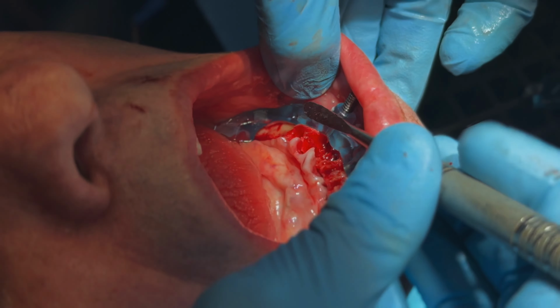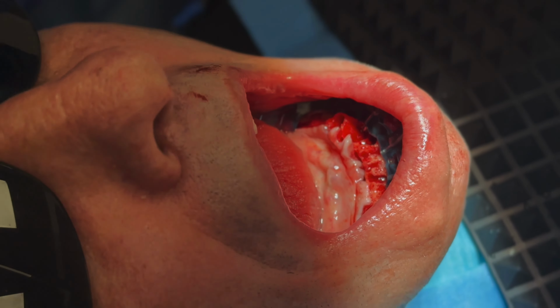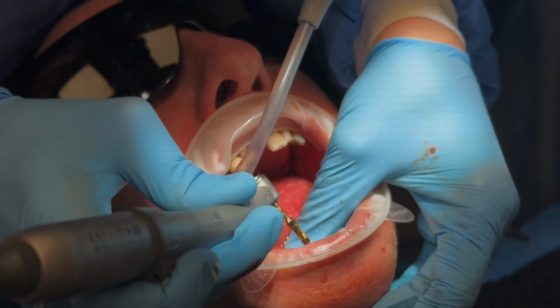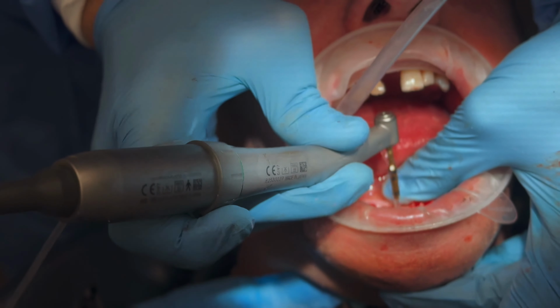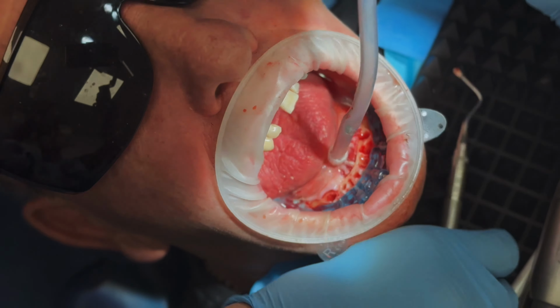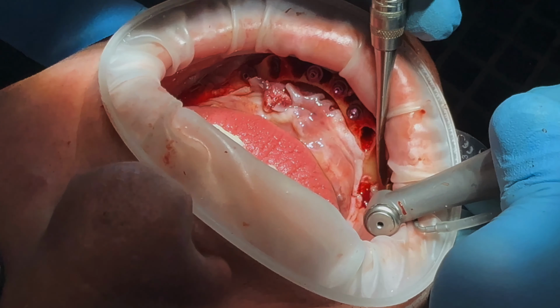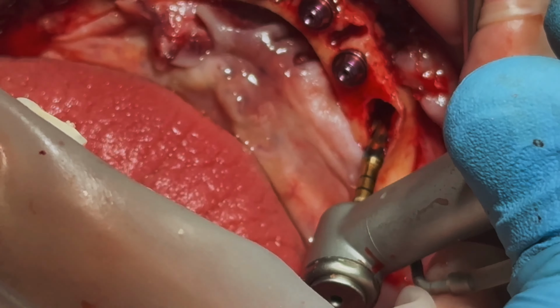So we've got the bone supported guide. This kind of tells us where to remove the bone as per the plan. So that's what we're going to do now. So now we're using an osteodensification burr to just condense the bone. It spins in reverse and it just condenses the bone. John, all okay? Mm-hmm. Bone is very good, yeah? That's what I noticed. So that's what you want to avoid, yeah? So we just drill in front of it.